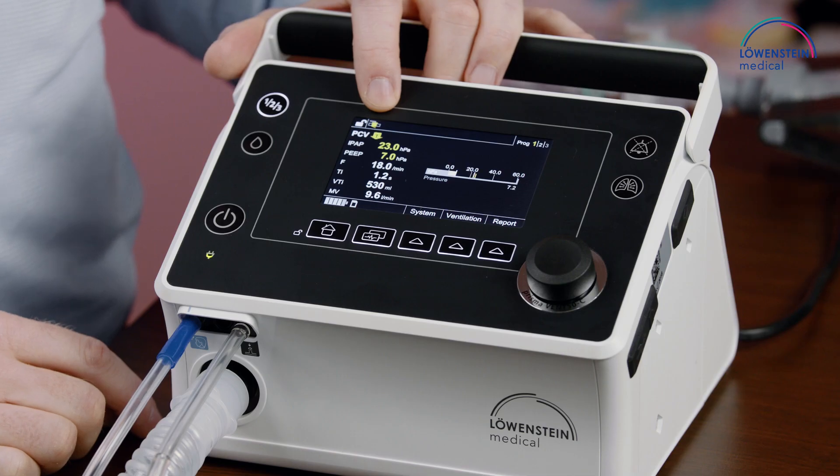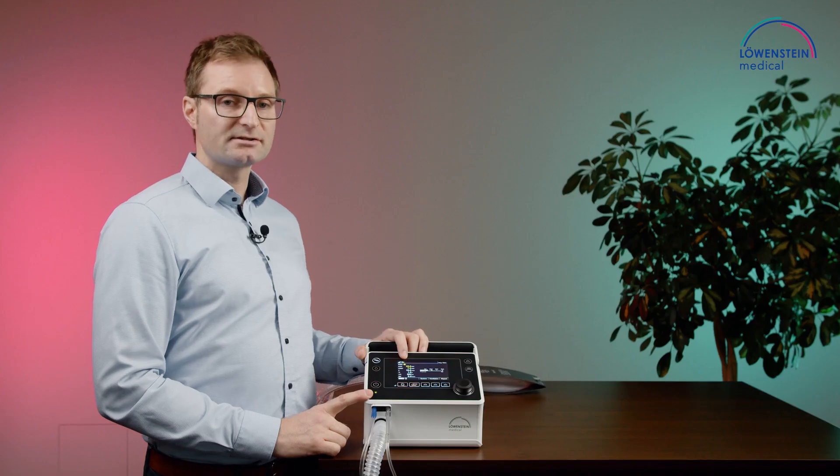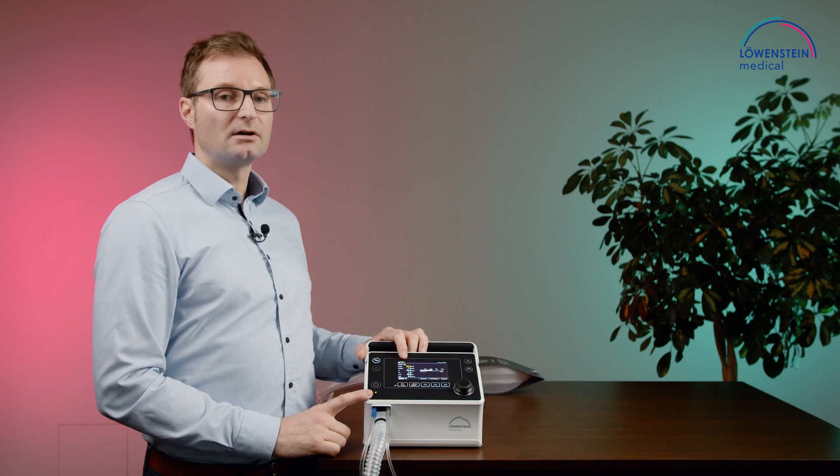There is the symbol for the used circuit system. You can use the device Prisma Vent 50 and 50c either in a leakage system or in a single valve system.